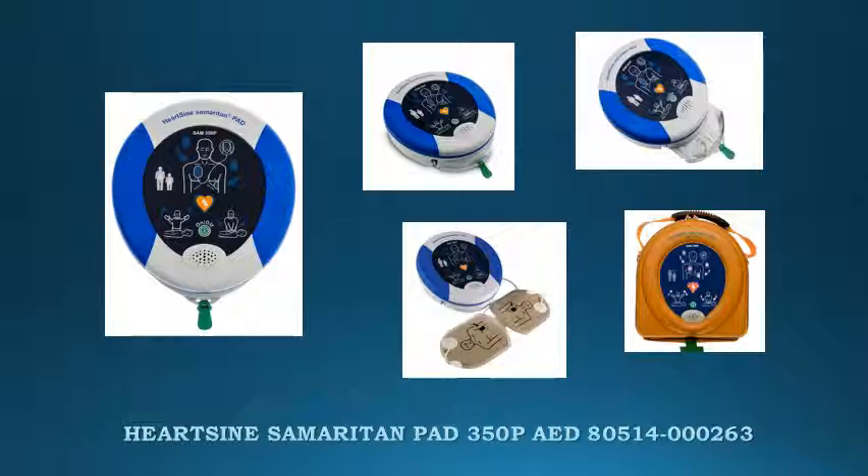Its advanced technology is balanced against the demands of real-world use. This device is also available in a fully automatic version, the HeartSign 360P-80.